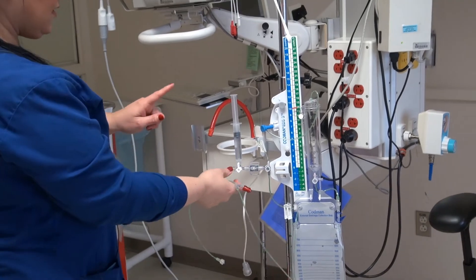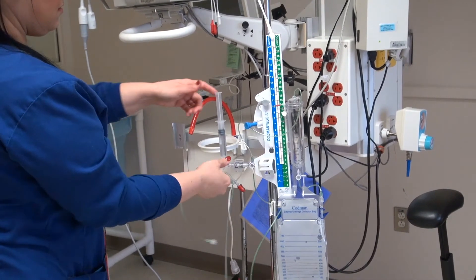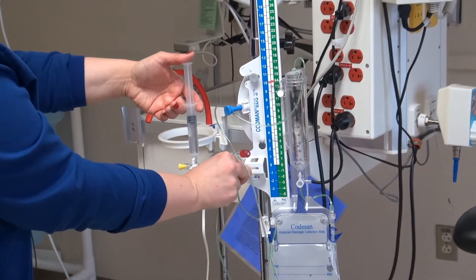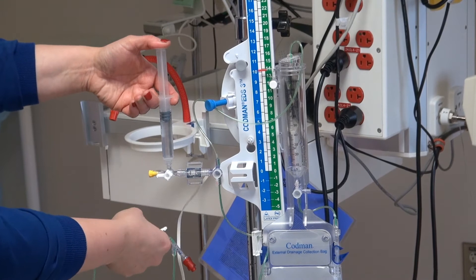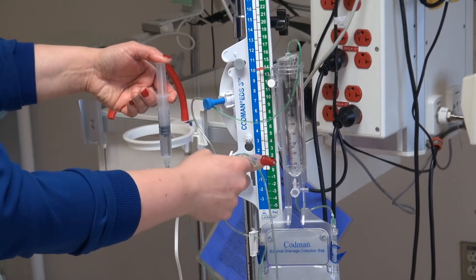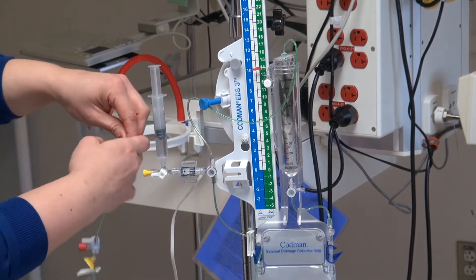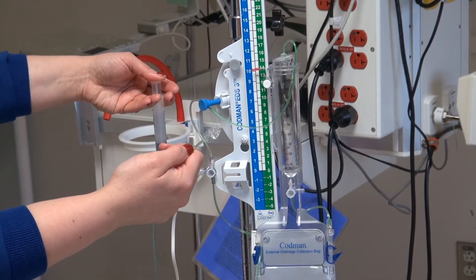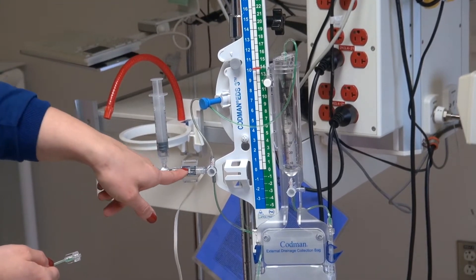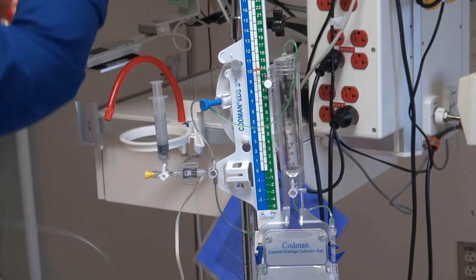We want to make sure that our line is flush and patent. So we want to open up our stopcock because we're going to flush to the chamber first. Then we'll go the opposite way and it should come out here. You don't want to push all the way down because you don't want this air bubble to come through the transducer, so we will switch out our syringe and shut it off.